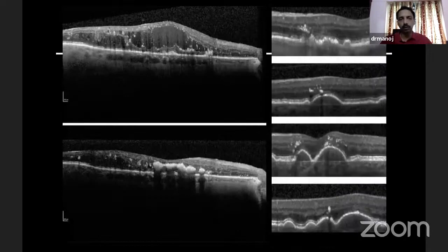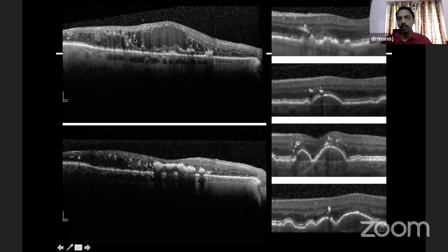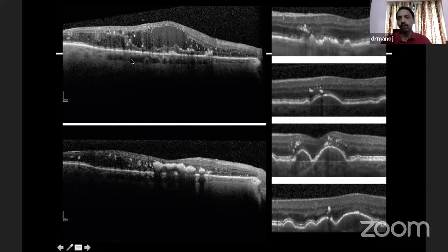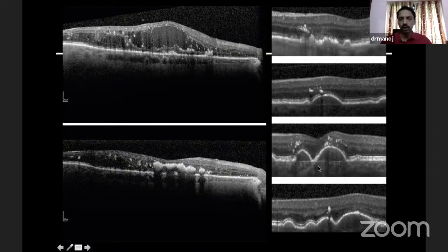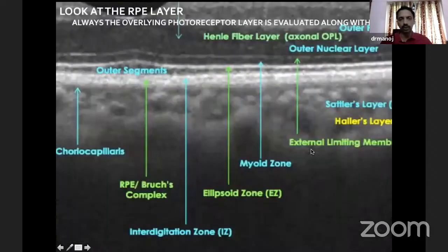Next, we look at hyperreflective areas. Sometimes some of these hyperreflective dots may be very small, and some may be very large or thick. These small things are called hyperreflective spots or dots, whereas the large ones represent hard exudates or intra-retinal hard exudates. These hyperreflective spots are seen not only in vascular pathologies, but can also be seen in age-related macular degeneration.